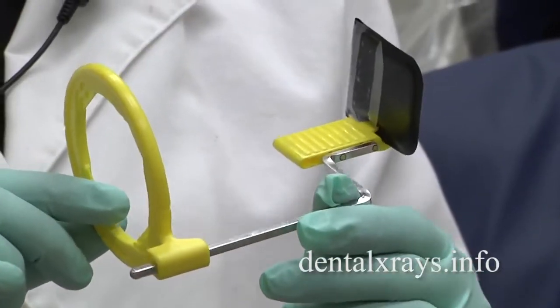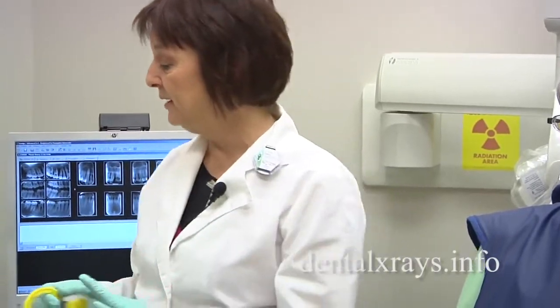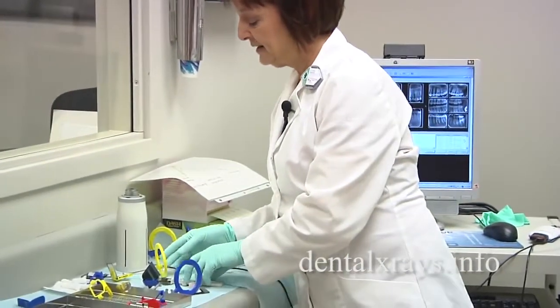This session is going to describe what bisecting angle is and actually how to use it. Many offices use the ring instruments, which helps with the bisecting angle because it's doing all the work for you. What happens is when you use a ring and the film slants in the mouth, the bar is telling you exactly what angle to use. Using the rings eliminates elongation, foreshortening, and overlapping. A lot of offices do not use this ring — they use the actual bisecting angle technique.